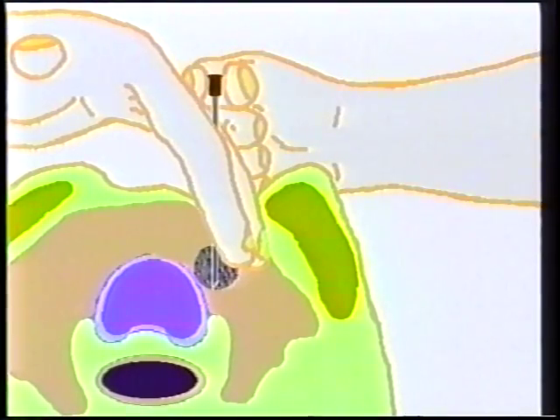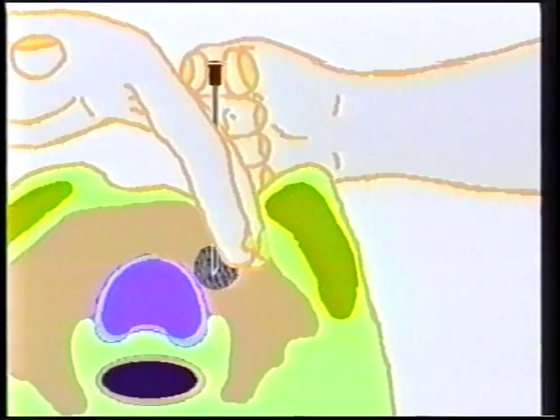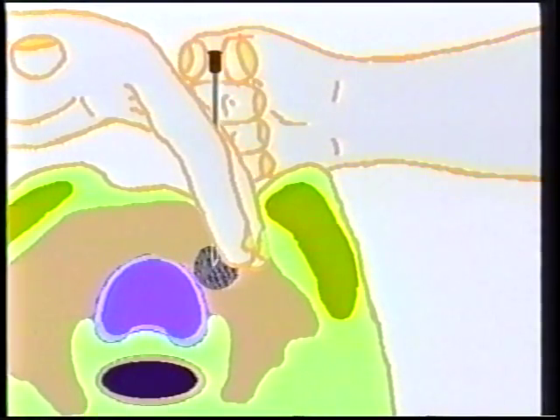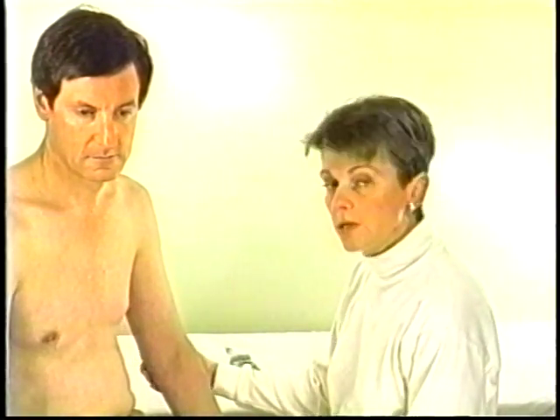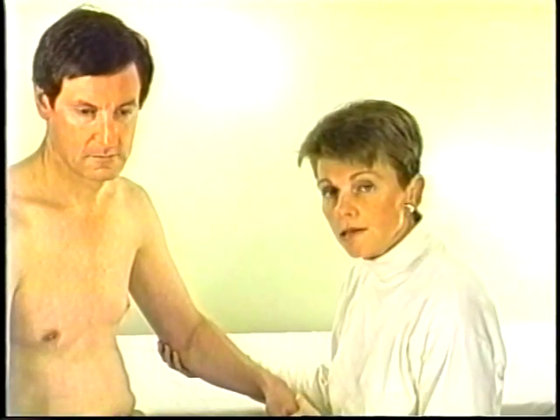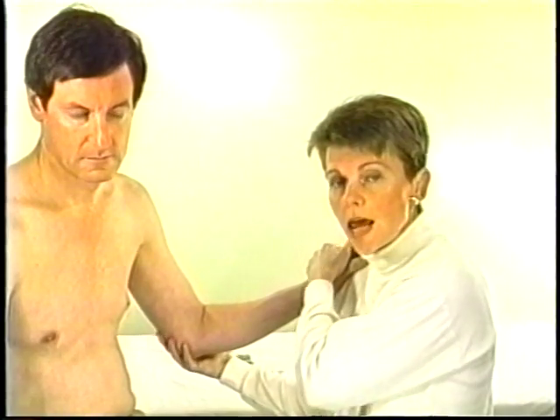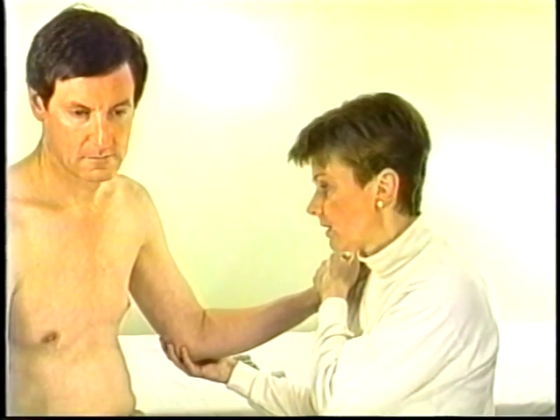Do remember, though, that suction alone will not produce a good sample. The needle technique without suction, described earlier, often works well in the thyroid gland. Targets in the axilla may be difficult to reach and to immobilize. The best position for the patient is to be sitting up with the arms slightly abducted and as relaxed as possible. One way of accomplishing this is to put the patient's hand on the operator's shoulder like this.